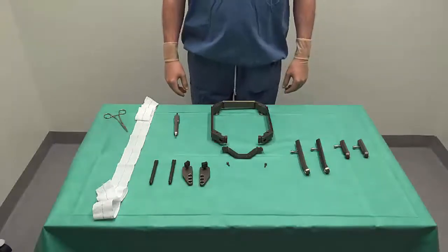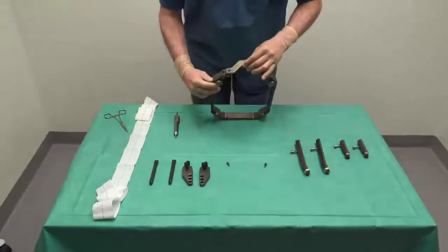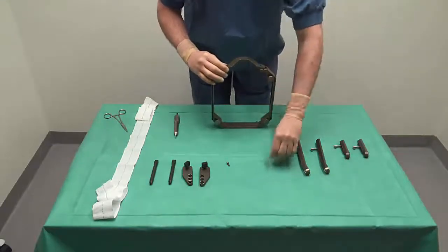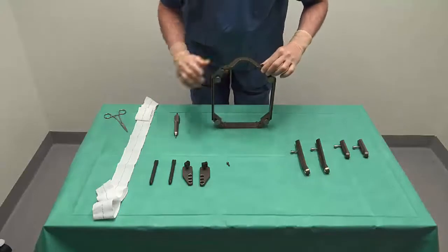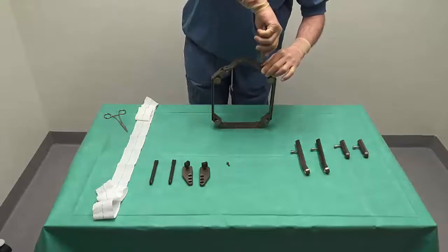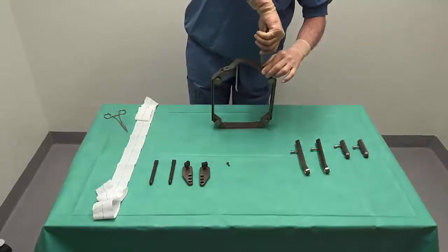Let us now look at a short video on how to assemble a frame. We start by putting the front piece in position and we fasten it with two screws. Remember that the feet should be down and the nose up so you don't put it upside down.